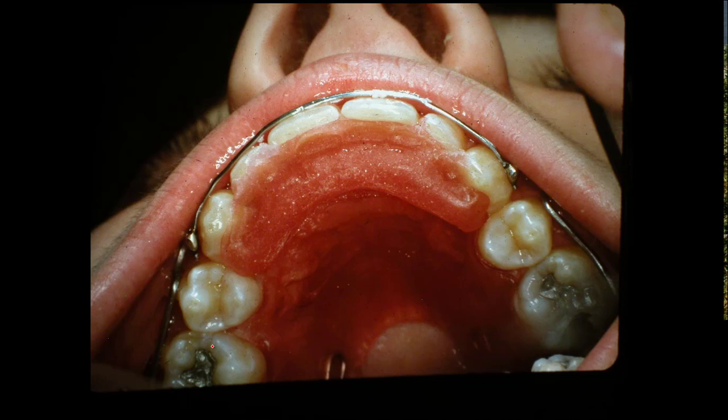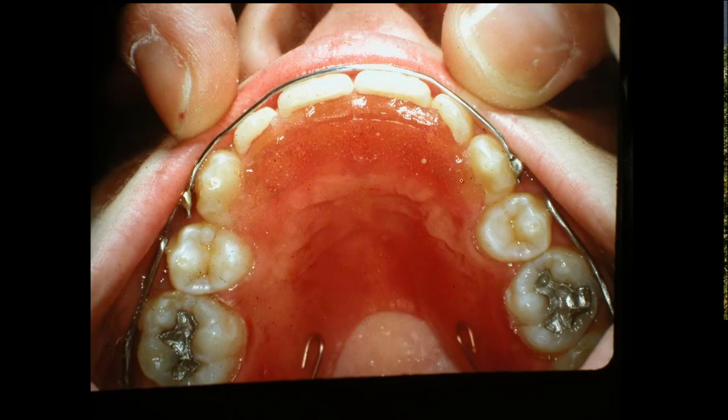Now here the bite plate is in here. If you don't have any TMJ problem, you can trim this off all the way up where you've just got the imprint of these teeth in here. This also holds your lower anterior teeth in position, but I still like to use a 3-to-3 lower retainer on the cases. This is one where we don't have any TMJ or we're not trying to hold the jaw forward — it just closes right in here and this will keep this bite relation as long as they use the retainer.